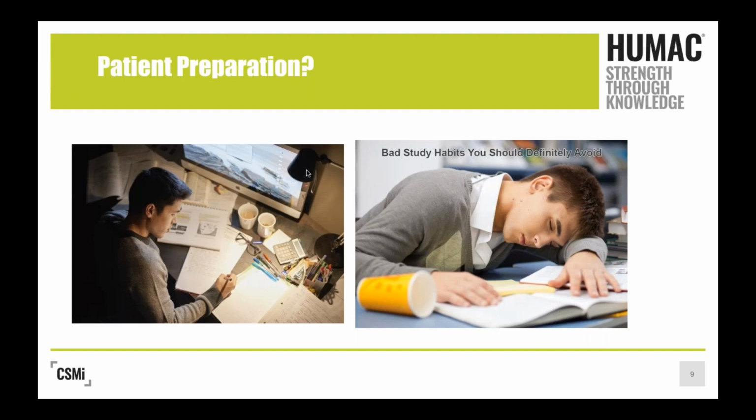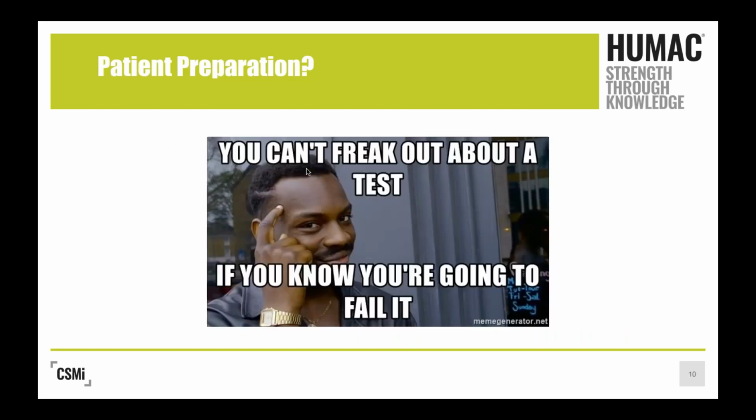Now, the next big question is, is your athlete prepared? Have they been a good student and prepared over the course of their rehab, or did they pull an all-nighter the last few weeks to try to get ready for the season? If this is your athlete, you should know where they are, either because you've included testing throughout the plan of care, as you'll see today, or because you've used the various training modules that we've described, and so you kind of know the torque amounts that they can produce and what their deficiencies are.